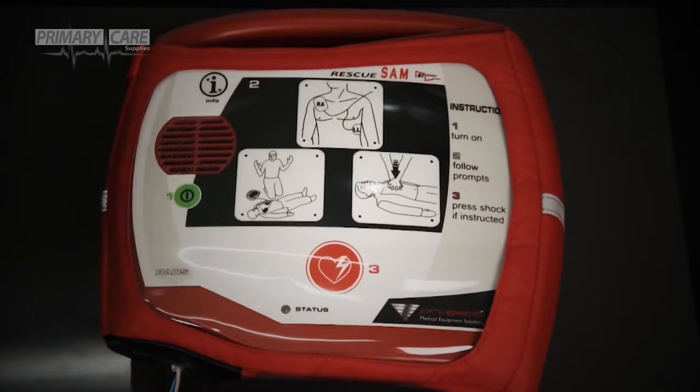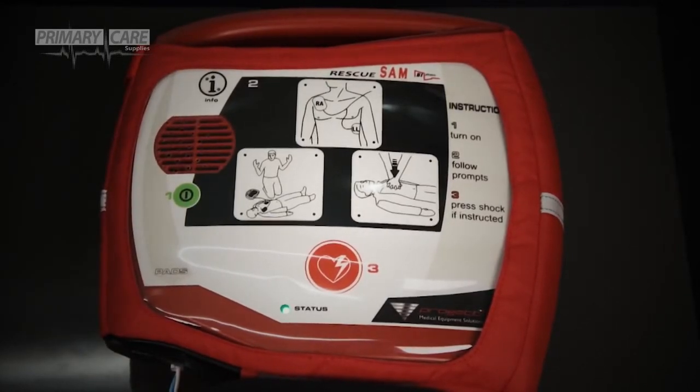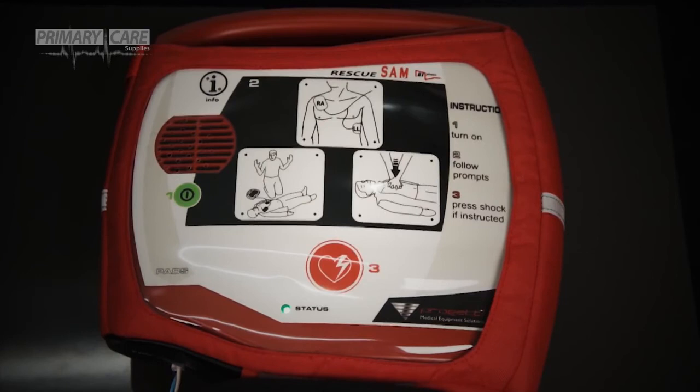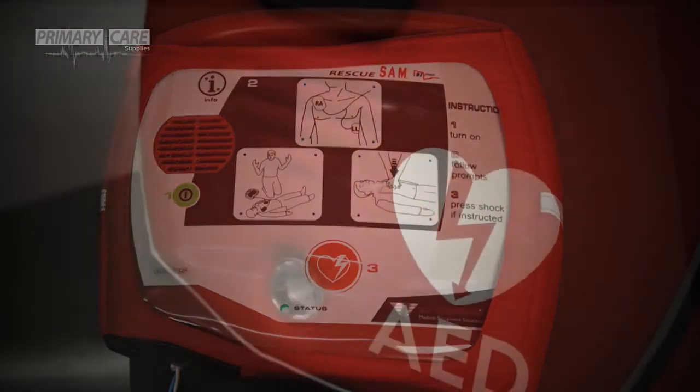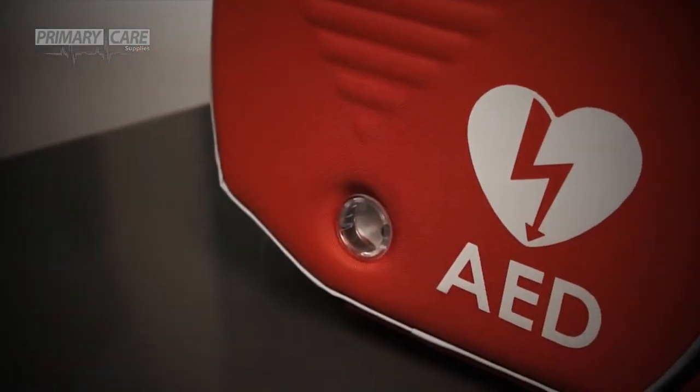Pressing the green power button will start up the defibrillator. Listen to the voice prompts and follow the instructions: "System ready. Call for help. Attach pads." When instructed, press the red shock button and listen out for further instructions.